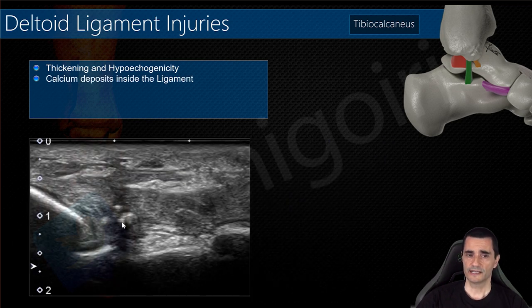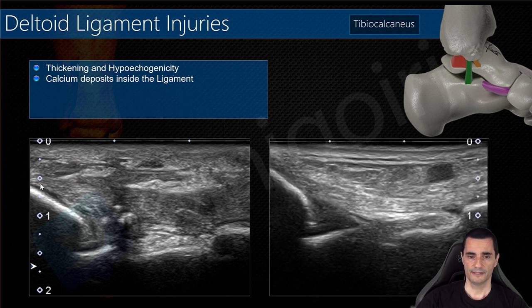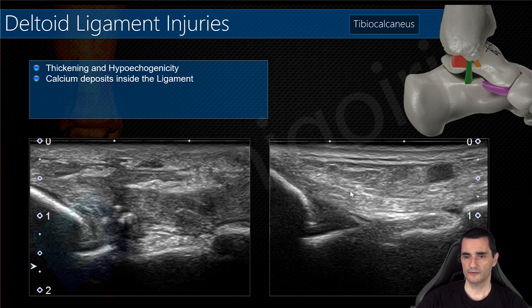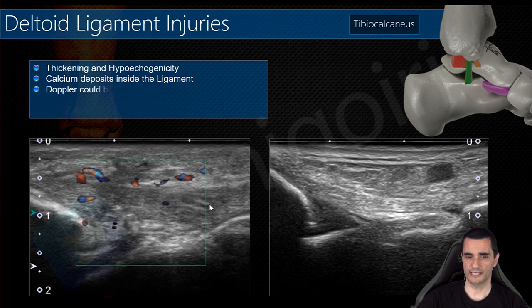Calcium deposits can be found inside the ligament as a metaplasia of the injured ligament. This is another example of hypoechoic thickening of the ligament and the normal side, in this case with calcium deposits inside the ligament and vascularization on Doppler.